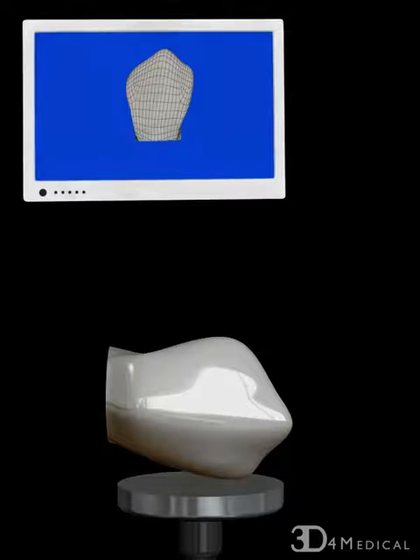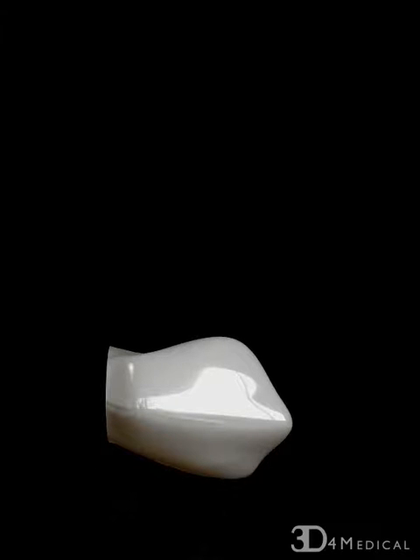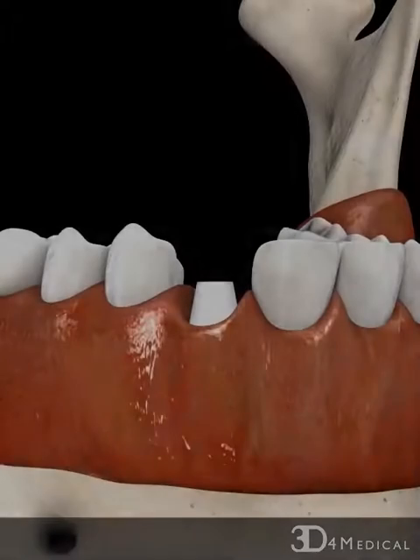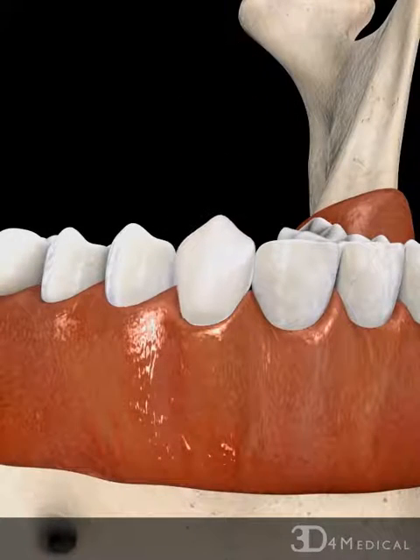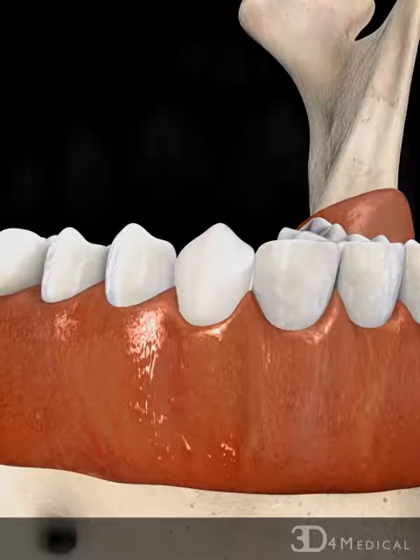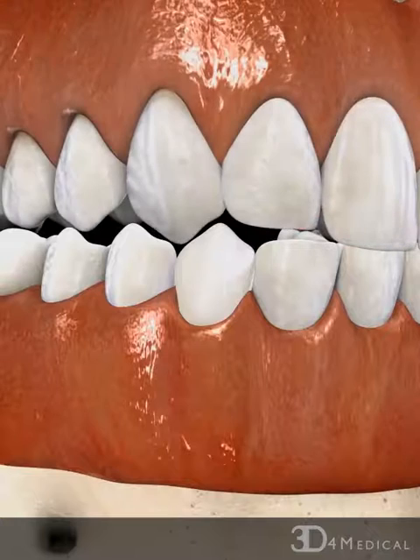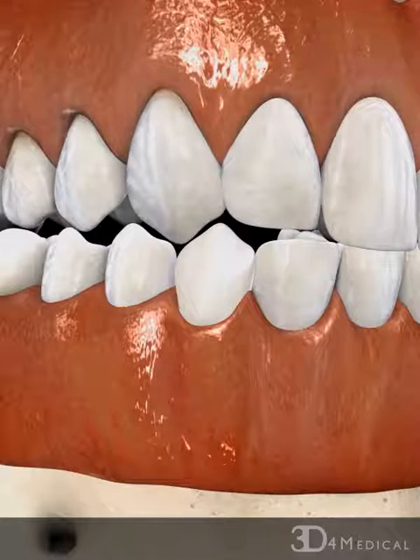When complete, the crown is sent back to the dentist where the dentist adjusts it to match the color and shape of the teeth before it is finally cemented in place over the abutment.